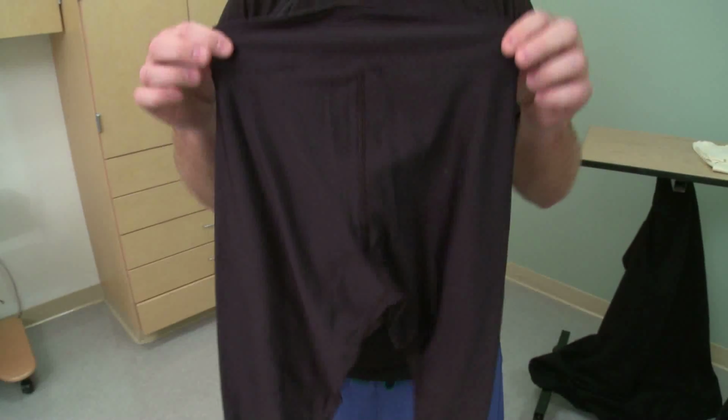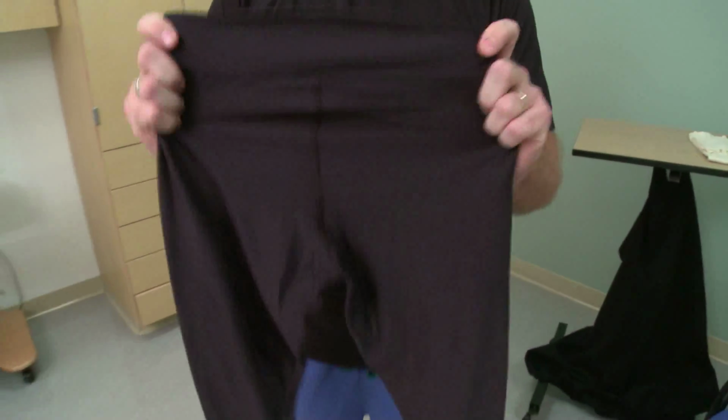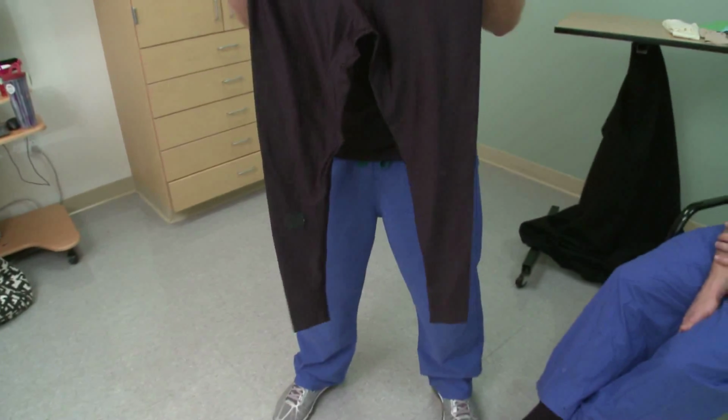This is an example of compression pants. They're tight and should fit tight. It's important that a person has multiple pairs of lower body compression so that when they're done bathing, lotioning, and inspecting their skin, they have another pair of pants ready to put on to start the 23-hour clock over again.